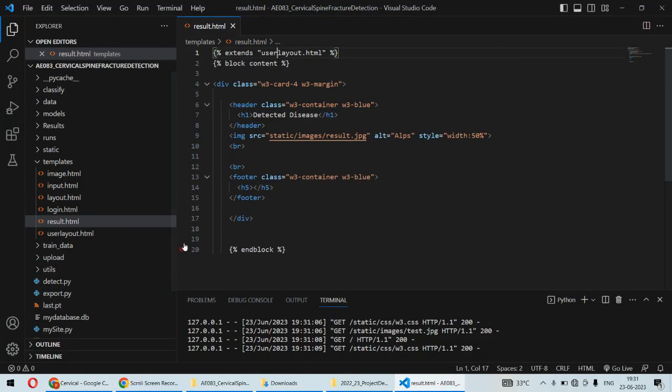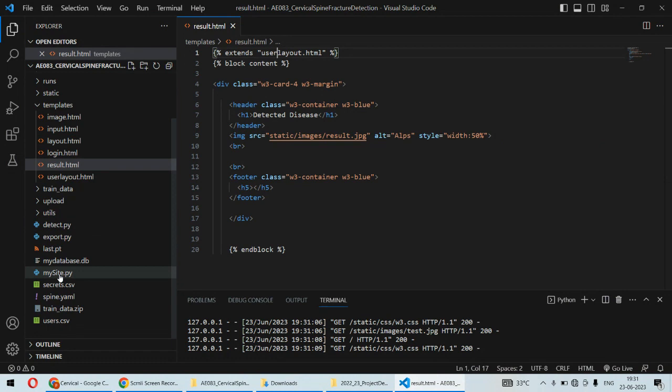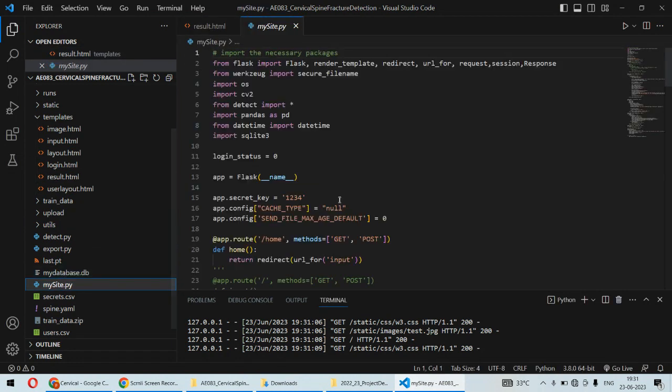Hello and welcome to our YouTube channel. In this video we are going to understand the demonstration of cervical spine fracture detection using deep learning or machine learning algorithm. For this project we are using the YOLO model.